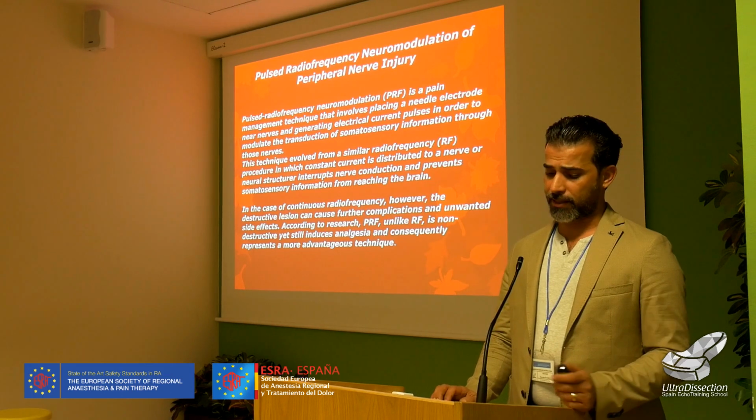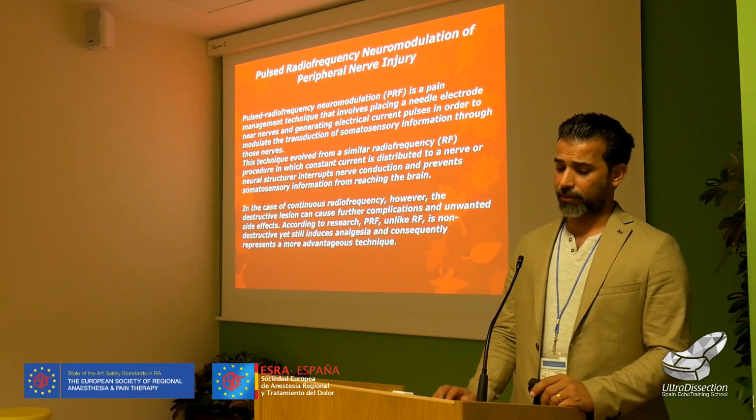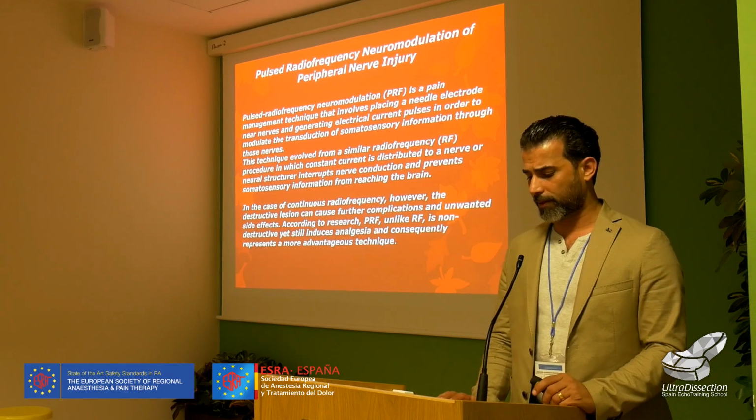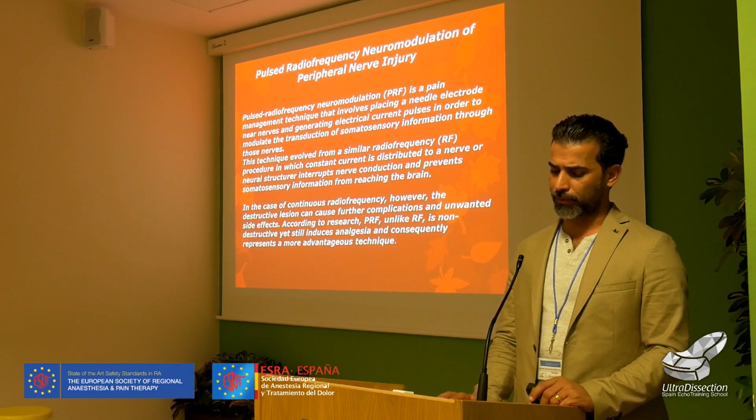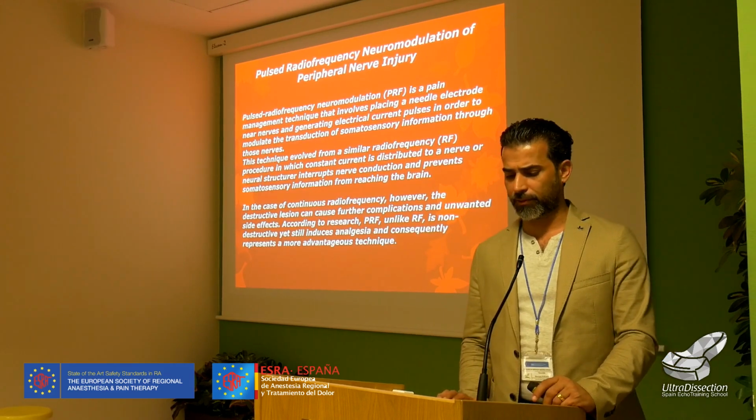Pulse radiofrequency is a pain management technique that involves placing the needle electrode near nerves and generating electrical current pulses in order to modulate the transduction of somatosensory information through the nerves.